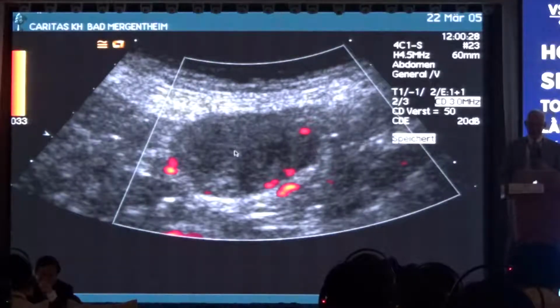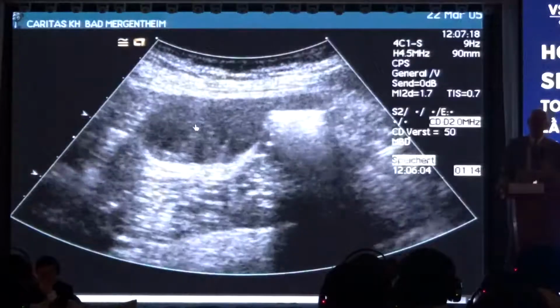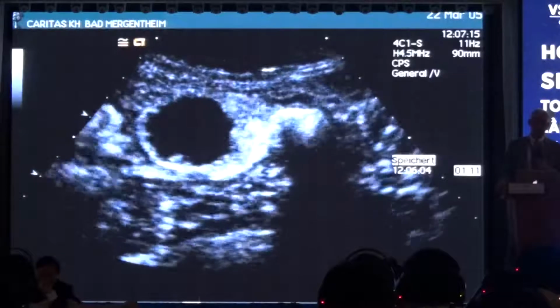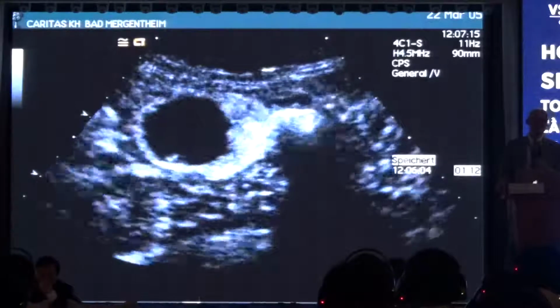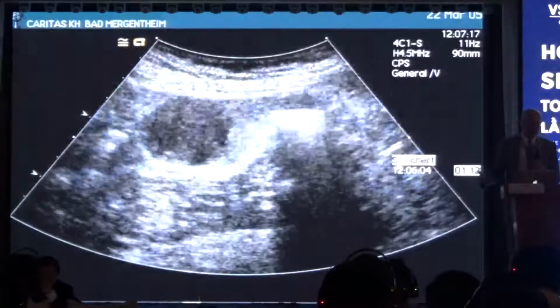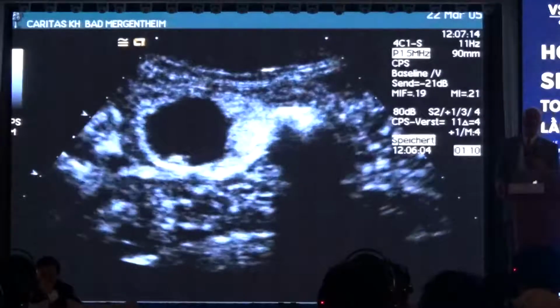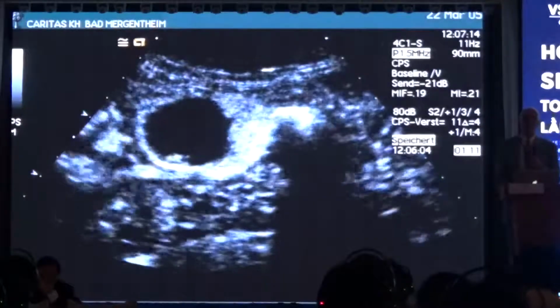Here you can see a GIST, and the eye-catching feature is that you have spontaneous necrosis even before any kind of treatment. And this spontaneous necrosis starts at the very beginning with a size of about 2 centimeters. Other subepithelial lesions like lipoma, leiomyoma do not display such spontaneous necrosis at this early size.